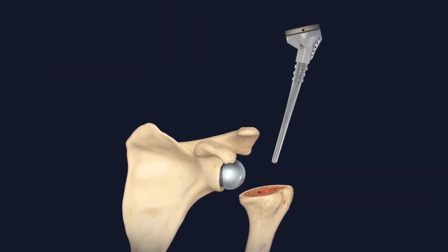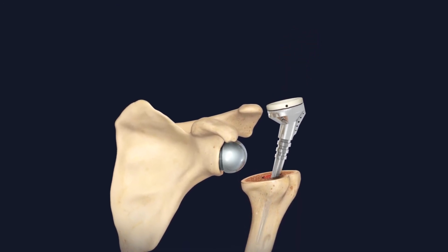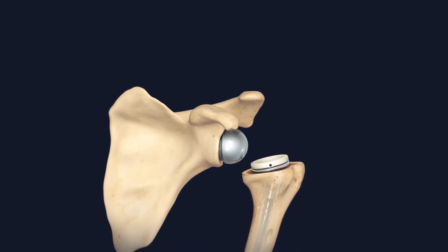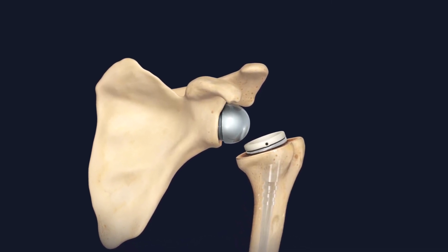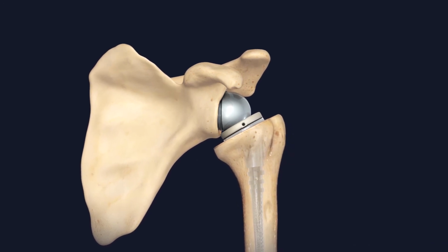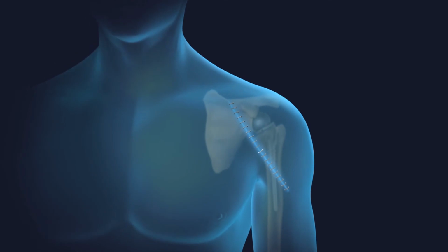The socket implant is on a metal stem. It will be inserted into the humerus. Finally, the surgeon will put the new joint together by inserting the ball implant into the socket implant. At the end of the procedure, the incision will be closed with stitches and staples.